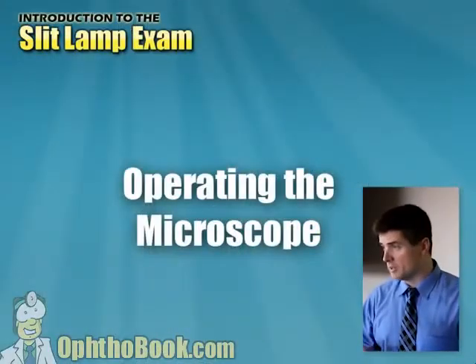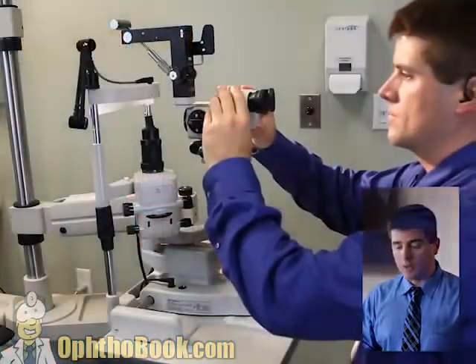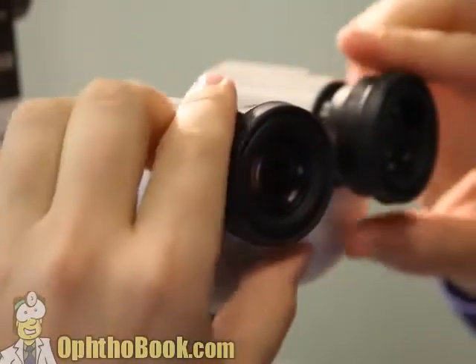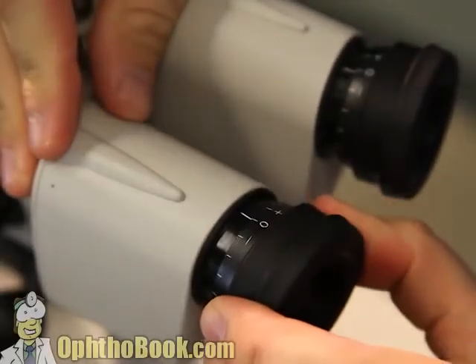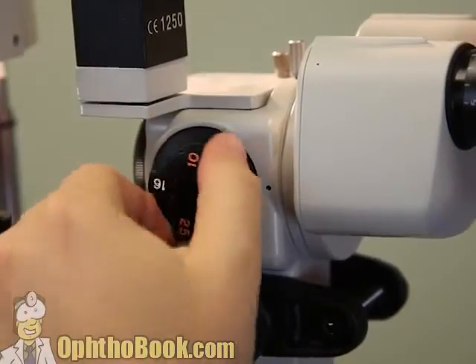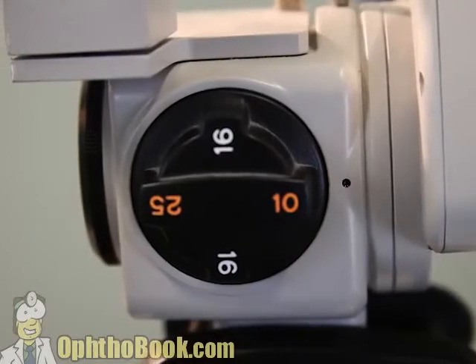Let's learn how to operate the microscope, and we'll start from the beginning as well. Of course, the first step is to get your eyepieces at the correct pupillary distance, and that's very easy. And then, of course, you set your dioptric power to your own eye. And for most of us here, it's probably set to 0. Use the magnification barrel. I like to work in the lowest magnification for the entire exam. I don't really need higher mag.